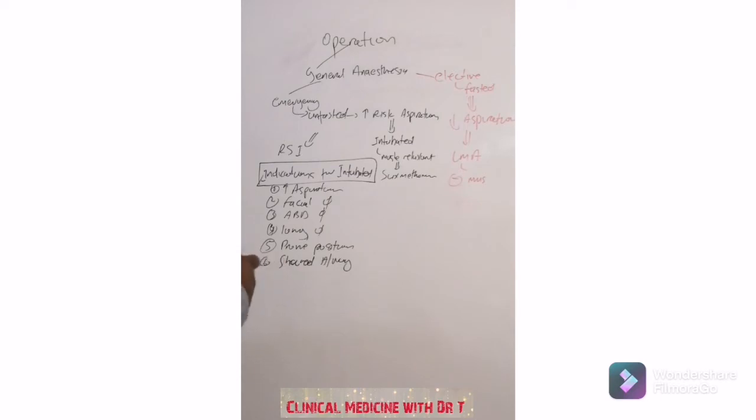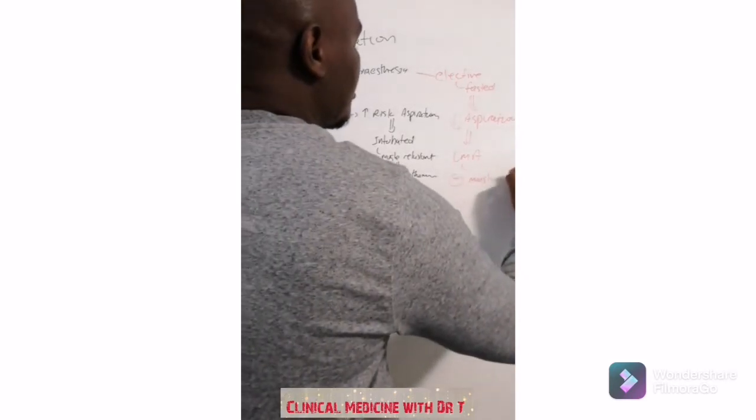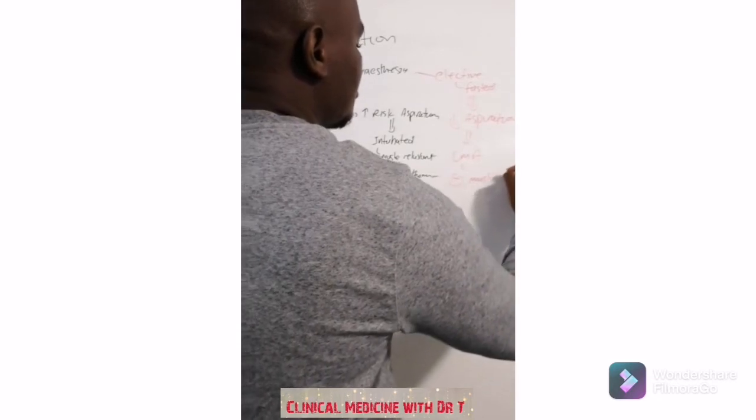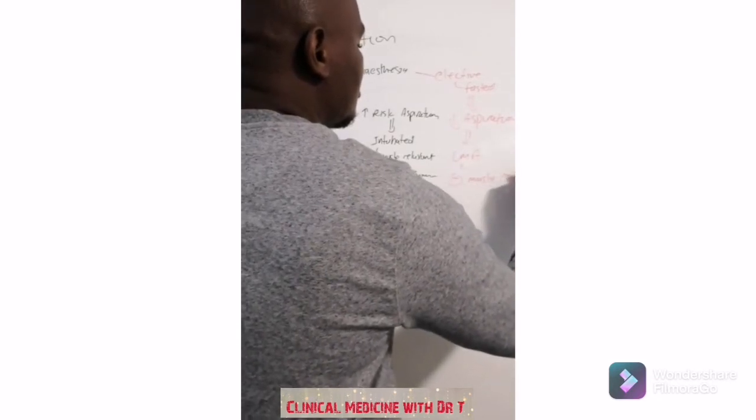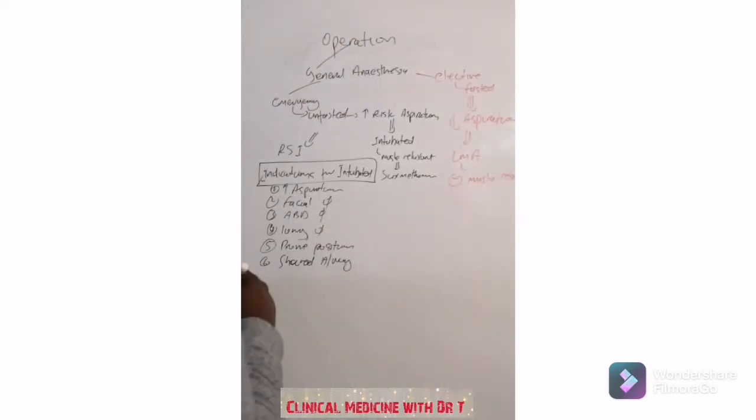And when you give a muscle relaxant to facilitate intubation, you want to relax those vocal cords, those vocal muscles. So there is no muscle relaxant required here. No muscle relaxant, right?